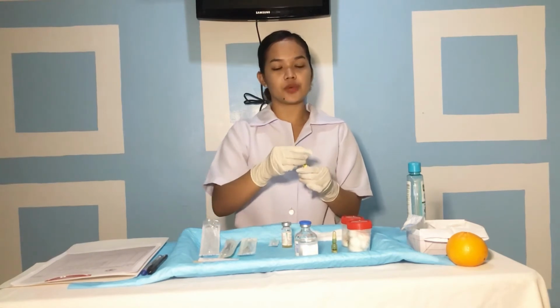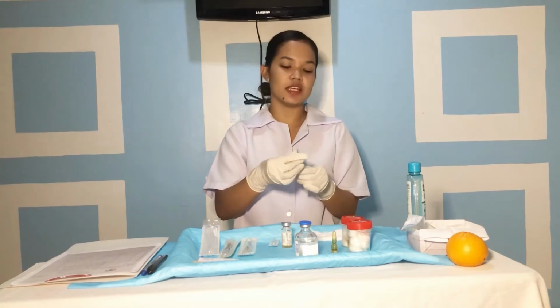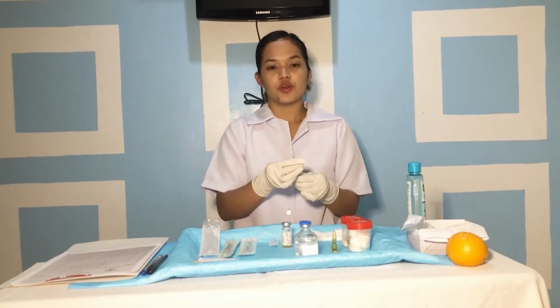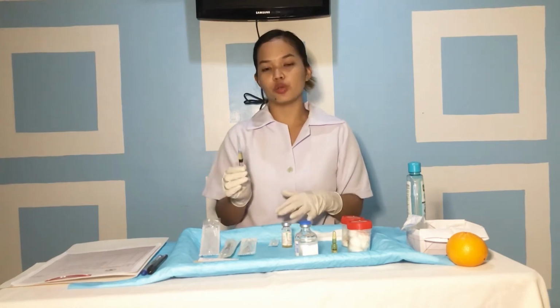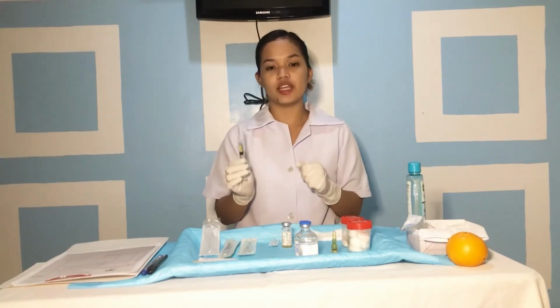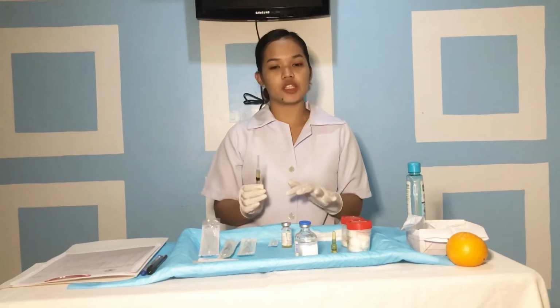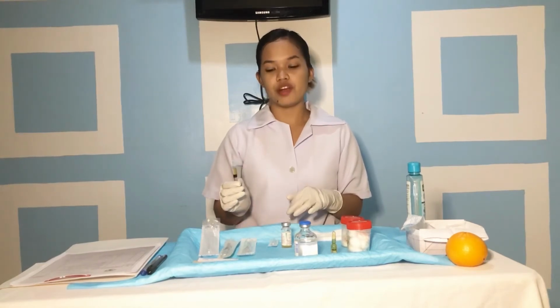Inserting the needle through the rubber stopper dulls the beveled tip, so a new needle is also sharper. For a multi-dose vial, make a label that includes the date of mixing, concentration of medication per milliliter, and your initials. This will ensure that future doses will be prepared correctly. And some medication needs to be discarded a certain number of days after mixing of the vial.